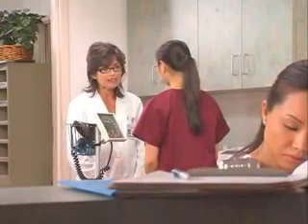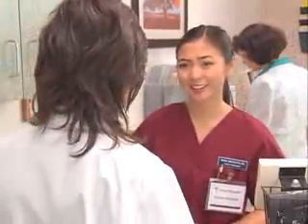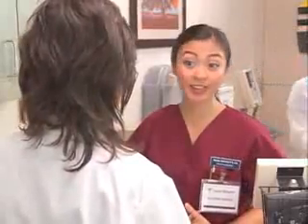So what are we doing for your patient, Rose? My patient was admitted last night after falling at home. She'd been having a problem with dizziness and lightheadedness. I need to assess her for orthostatic hypotension. Which is? Orthostatic or postural hypotension is a low blood pressure condition. It's defined as a drop of at least, is it 20 millimeters mercury systolic or 10 millimeters mercury diastolic in blood pressure within 3 minutes of quiet standing up after having been lying down.